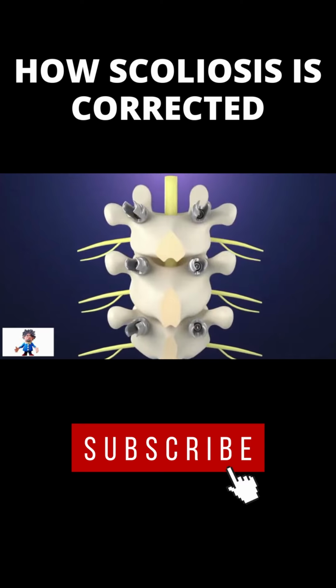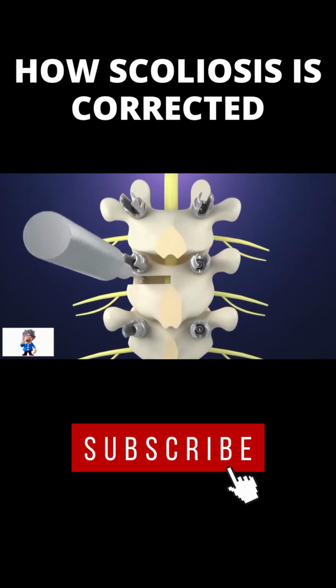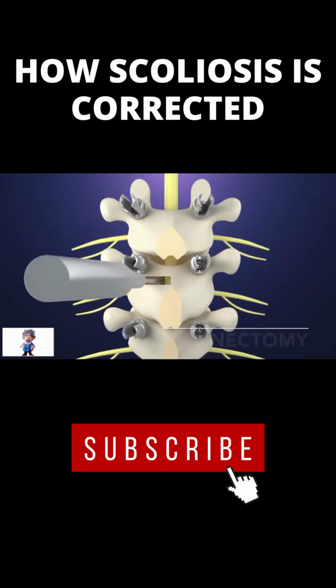Then, using a surgical instrument called a burr, the vertebral laminae are cut out, in a procedure known as laminectomy.